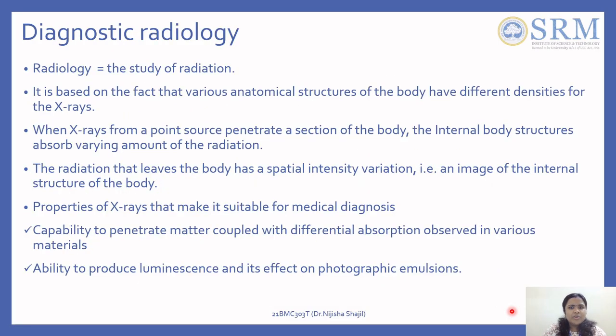Before we go into understanding X-rays, let us see what we mean by radiology. Radiology is nothing but the study of radiation. It is based on the fact that various anatomical structures in the body, the heart, the different organs, the different veins, arteries, muscles, everything, each and every part has different densities.